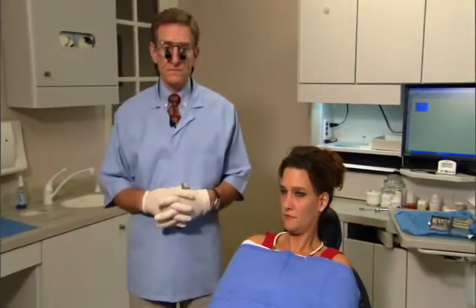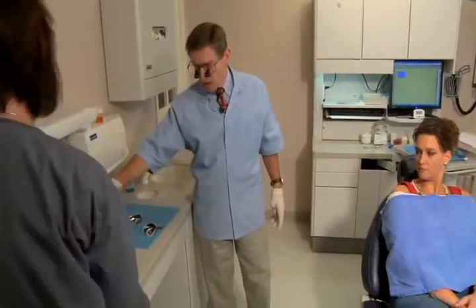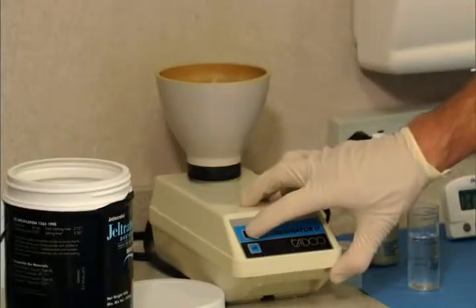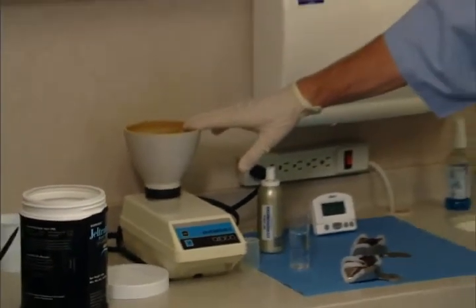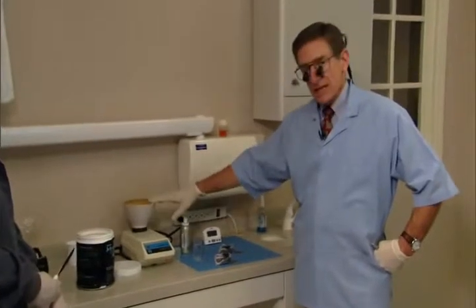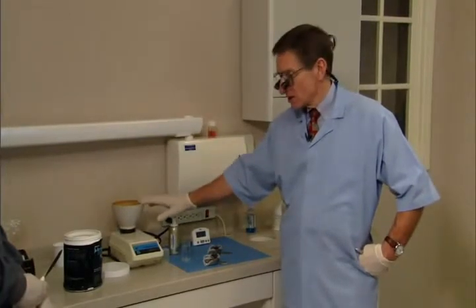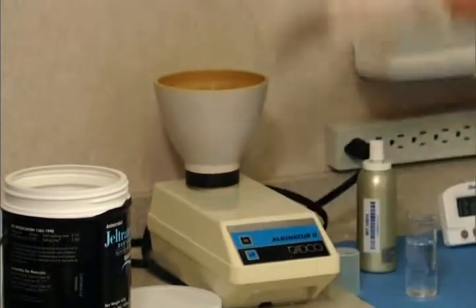Doing this as a four-handed procedure, Kathy will mix the alginate using a machine called an alginator — a bowl on a turntable that spins around. Measure out your powder and liquid — don't eyeball it. Measure to the manufacturer's recommendations. As you mix, it presses the alginate against the wall of the bowl. We'll do the upper alginate first.